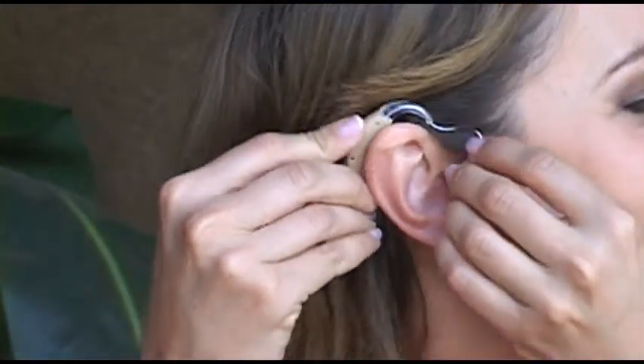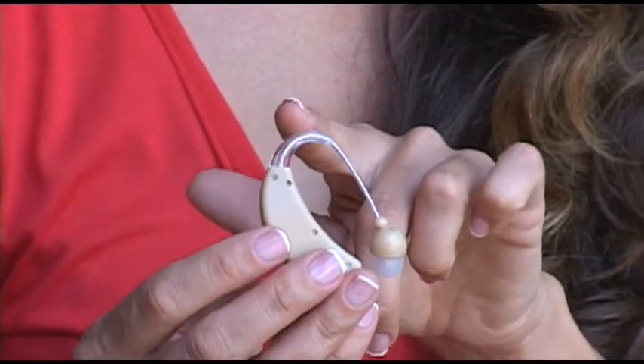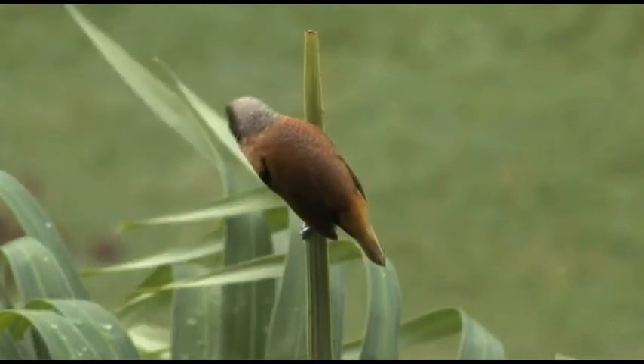How do you go from ordinary hearing to super hearing in seconds? Introducing the ClearHear HD Premium Sound Amplifier. Now you can listen to all of nature's sounds, only better.